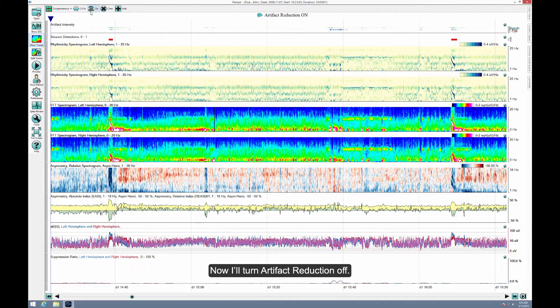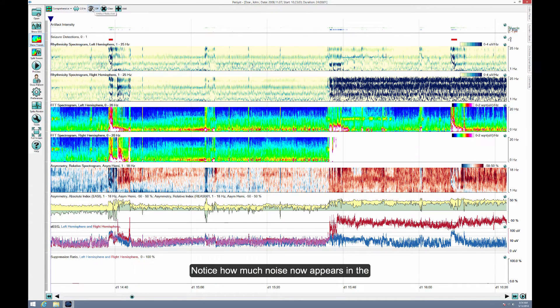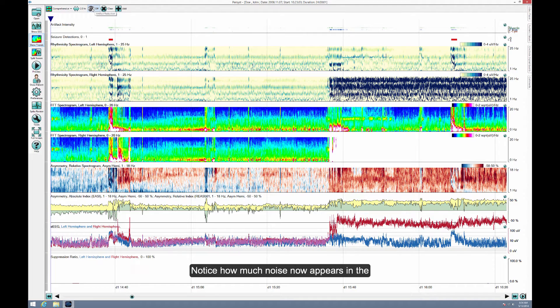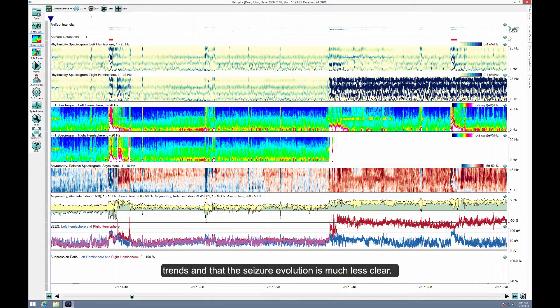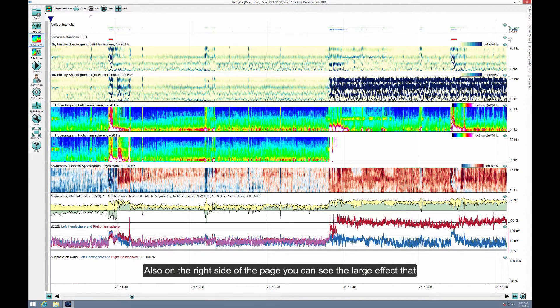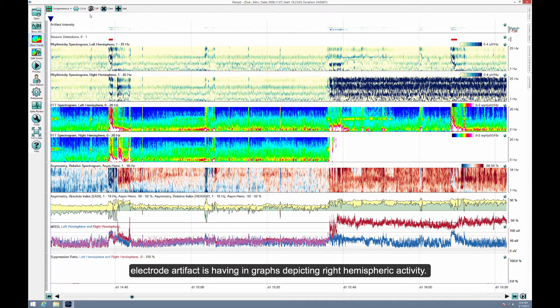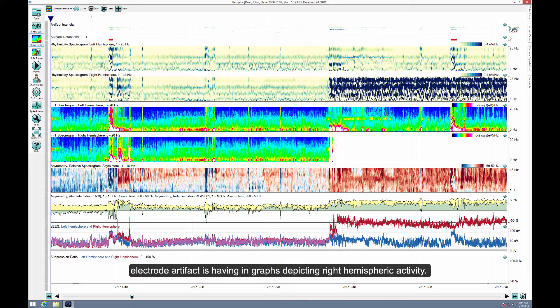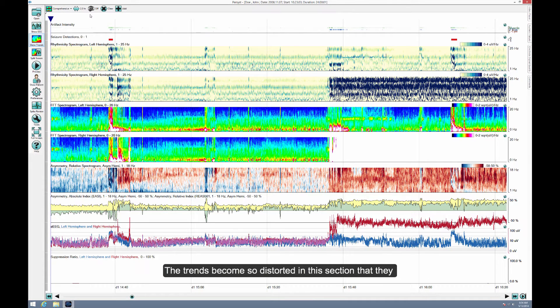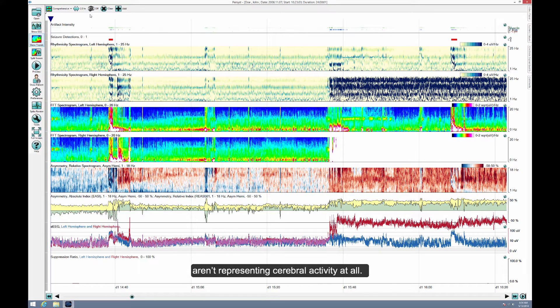Now I'll turn artifact reduction off. Notice how much noise now appears in the trends, and that the seizure evolution is much less clear. Also on the right side of the page, you can see the large effect that electrode artifact is having in graphs depicting right hemispheric activity. The trends become so distorted in this section that they aren't representing cerebral activity at all.